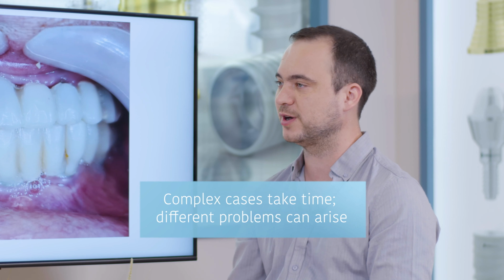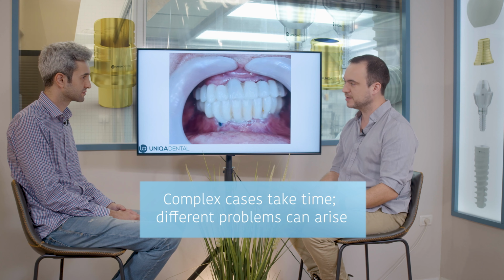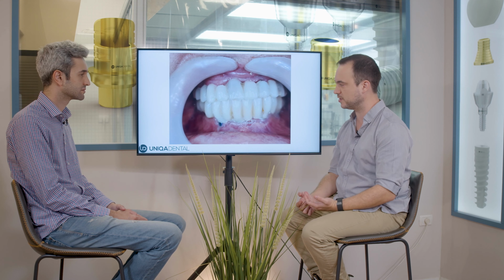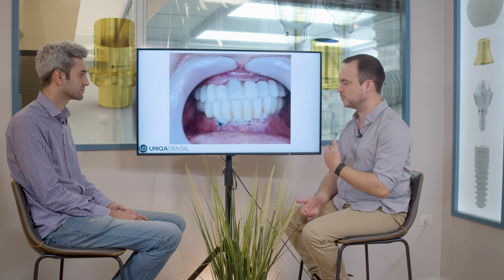It's a process because you have problems, you have different things that you didn't think about. You have some misalignments in the impression taking process because the blood, the clots, the gingiva, everything is interfering in the scanning process. The main point is that you're not doing it in one visit. You need to take the time to make it perfect. So in the end, you'll get a perfect result. This is still not a perfect result, but it's getting closer.